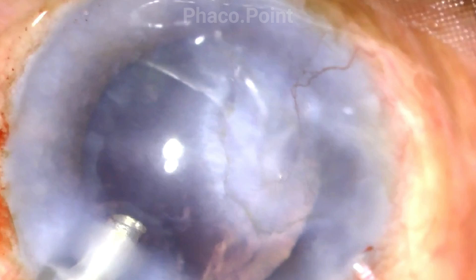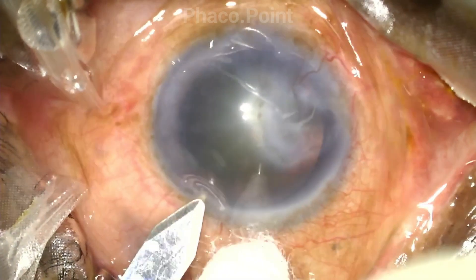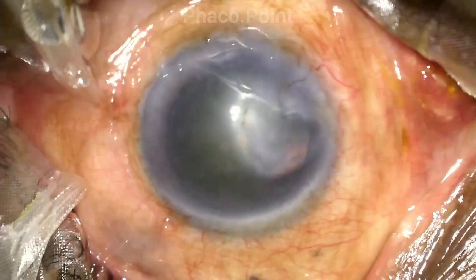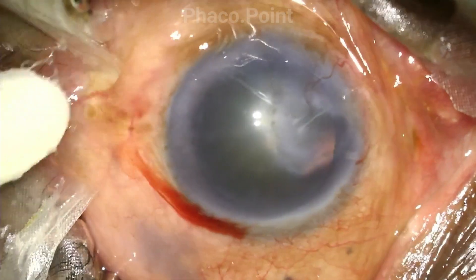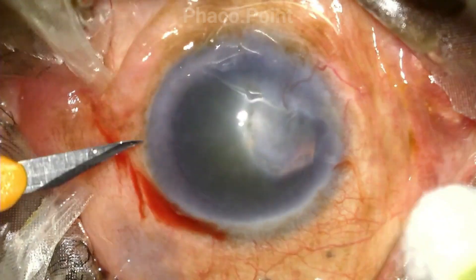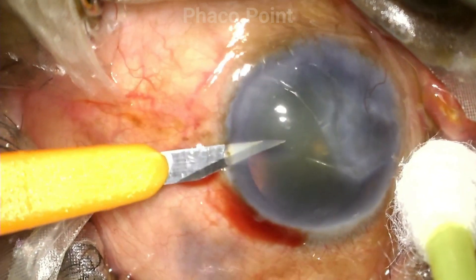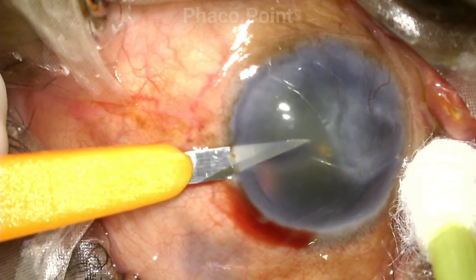In a case like this, whilst making the incisions one can consider moving the incisions around so as to take advantage of the clear cornea, ensuring maximum visibility when performing the steps of phacoemulsification.